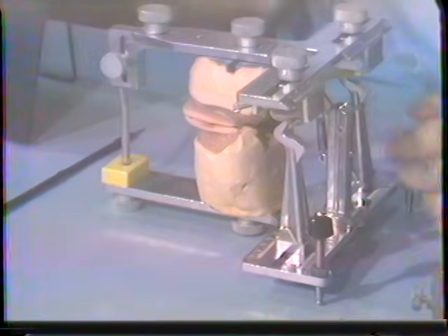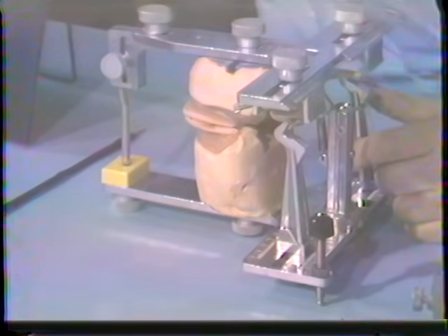Another record really that can be made is an engraving method or a stereographic method.